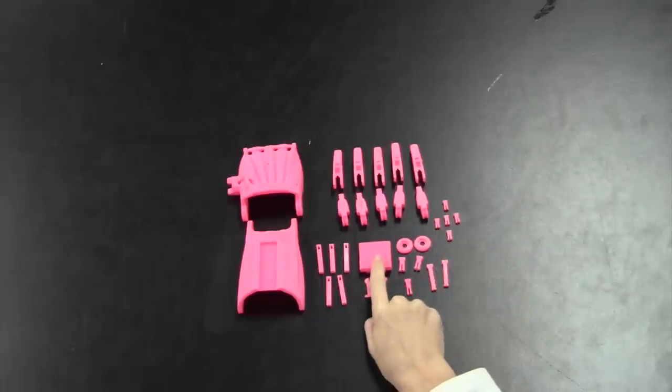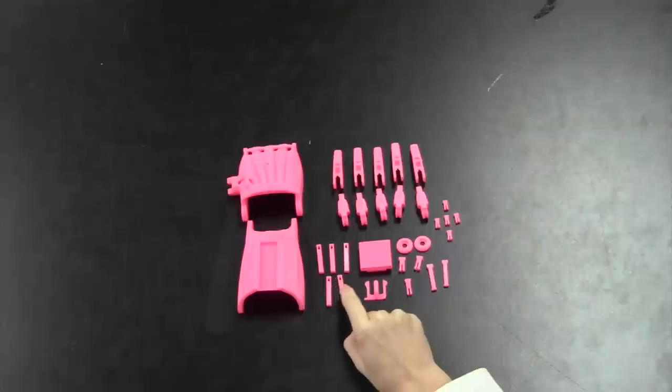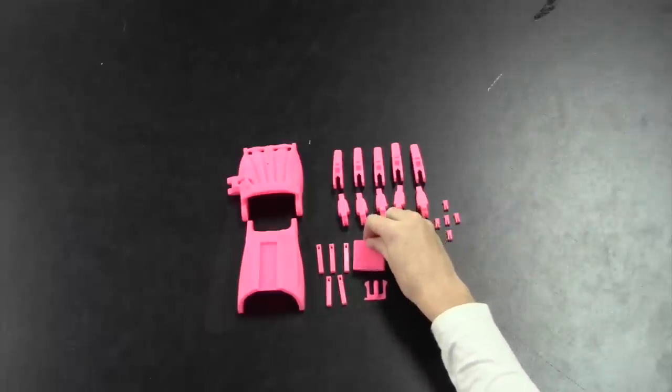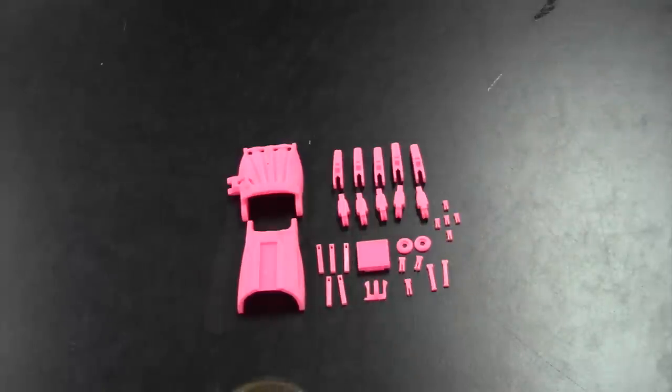Next you'll need one tensioner and a re-tensioner clip. Then you'll need five little pins that go inside the tensioner, also known as tensioner pins.